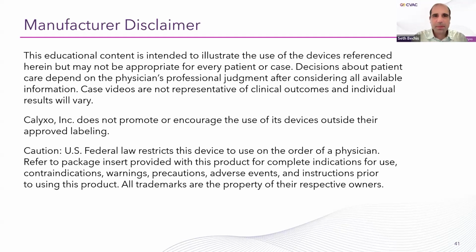Yeah, I think that's a great point. And as with any new technology, as a surgeon incorporates it into their practice, I think it is important to note that there is a learning curve. Fortunately, the learning curve is not steep with this device, but I think there are tricks and techniques that are worth taking the time to familiarize yourself with. And so in terms of early patient selection, like Dr. Winoker mentioned, choosing easier, more straightforward cases like a 1.2 centimeter renal stone, just to get a feel for the technology, I think is always a good way to start.